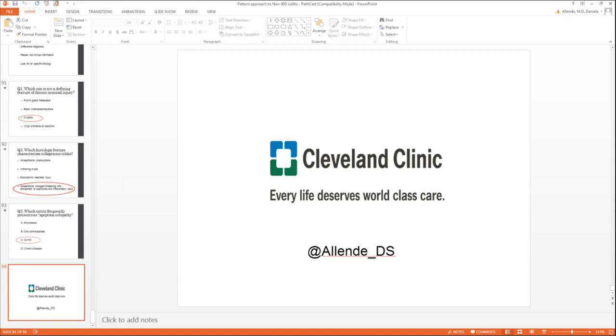Oh, great. I can probably follow up on that one because I can't remember the exact one that we use. But I have to tell you something very interesting about this antibody. We used to have a different antibody from one of the companies. And I had a case, actually the case that I showed you, that is pretty classic. I was pretty convinced on the H&E that it was adenovirus. Then when we did the stain, it came back negative. And I'm like, there's no way, this has to be adenovirus.